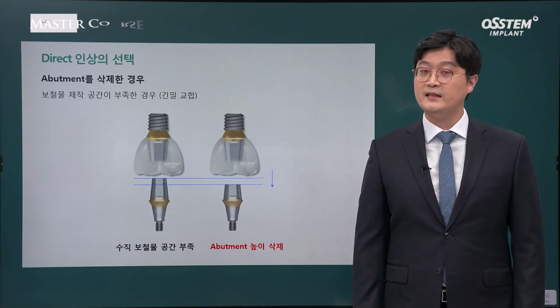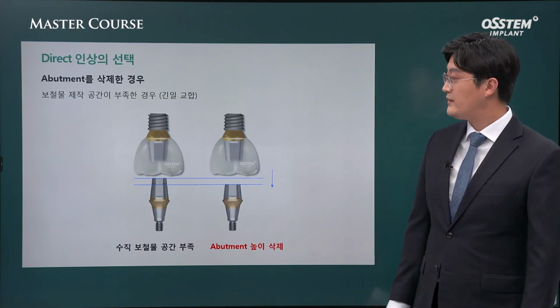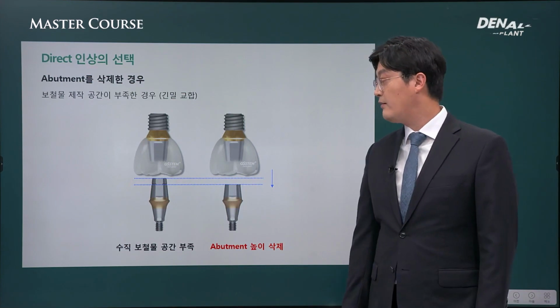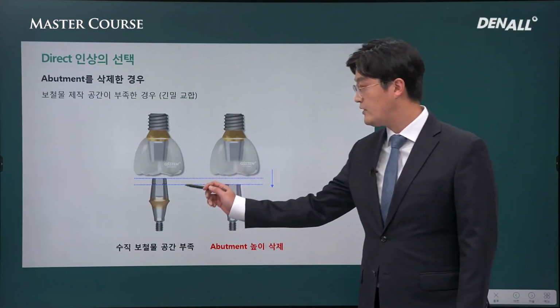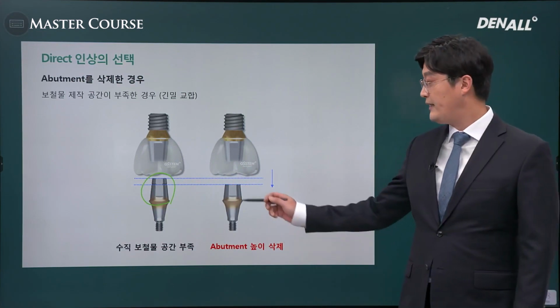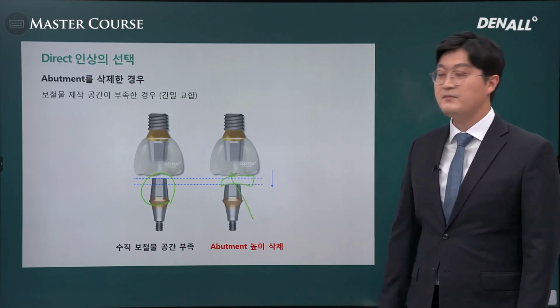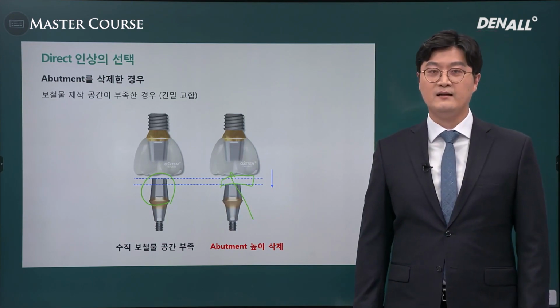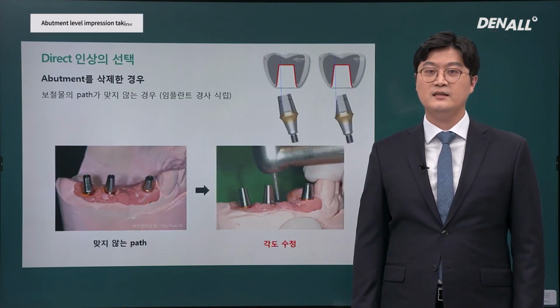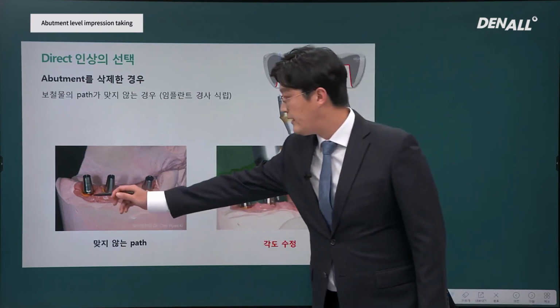If an abutment is reduced, direct impression taking should be done because a stock lab analog based on a stock plastic cap is a copy of an abutment that is not reduced. So if an abutment is reduced in height or on the side, the lab analog will not work. So direct impression taking is the only option here.